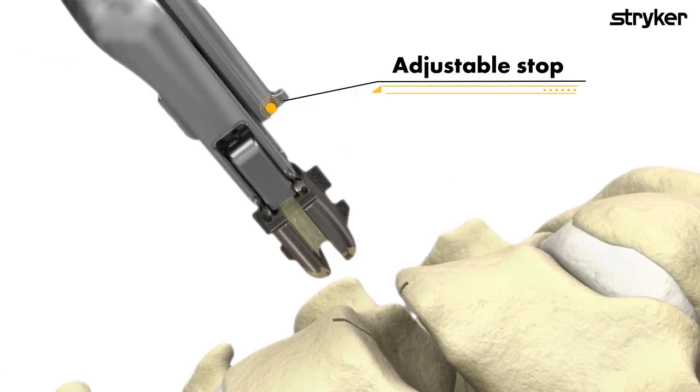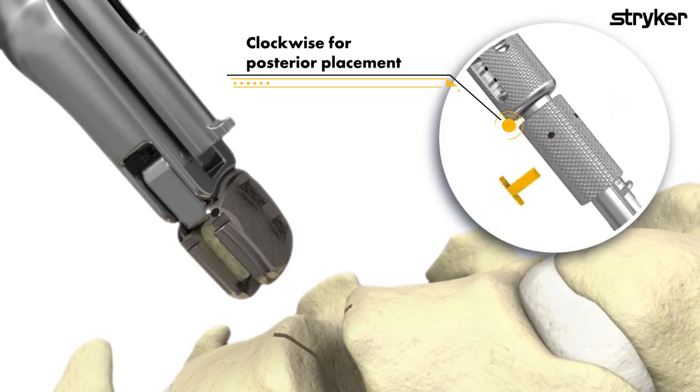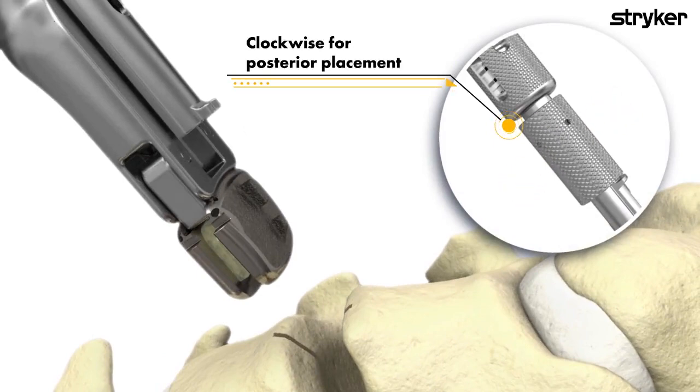from the anterior edge of the vertebral body. Prior to implantation of the disc, rotate the central knob in a counterclockwise direction for a more anterior placement of the disc, and clockwise direction for a more posterior placement of the disc.